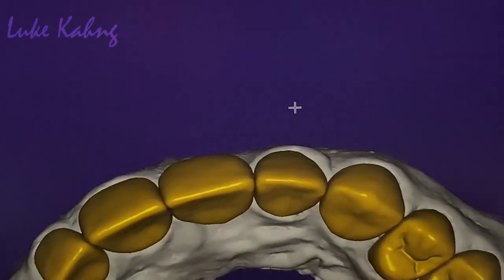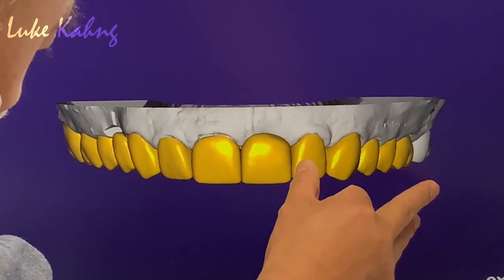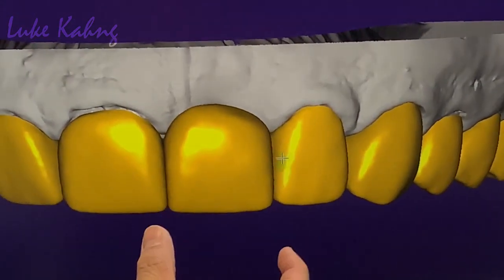Now see, it's golden proportion wise. Let me see this. There's a wide, there's a small, so I don't need this line angle here. Line angle here is better, and they look wider.